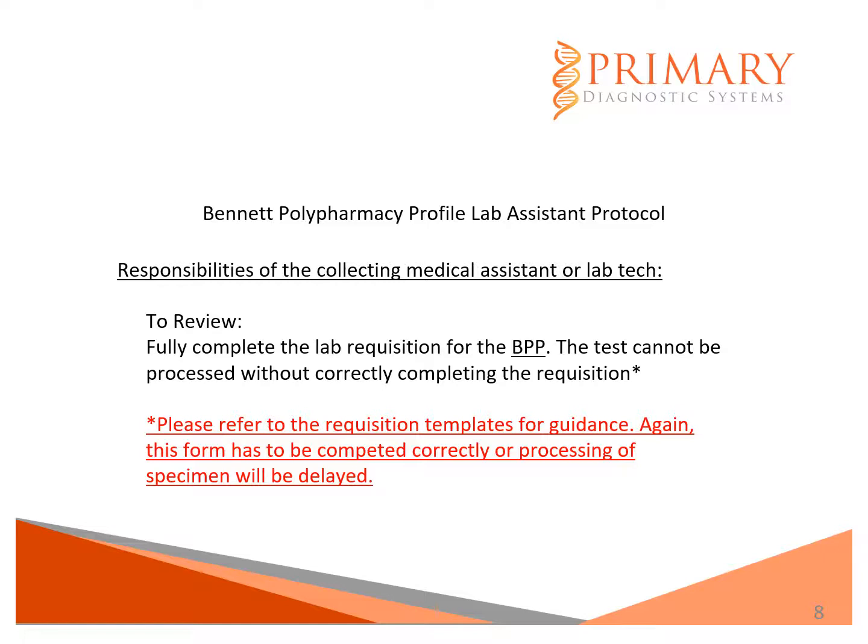To review this process, the medical assistant or lab tech must fully complete the lab requisition for each BPP. Again, the test cannot be processed without correctly completing this requisition. Please refer to the requisition templates for guidance. Again, this form has to be completed correctly or processing of the specimen will be delayed.